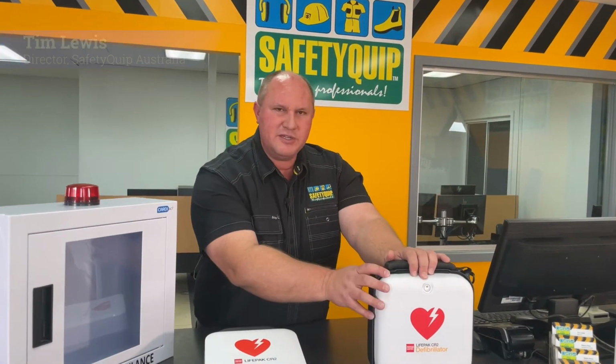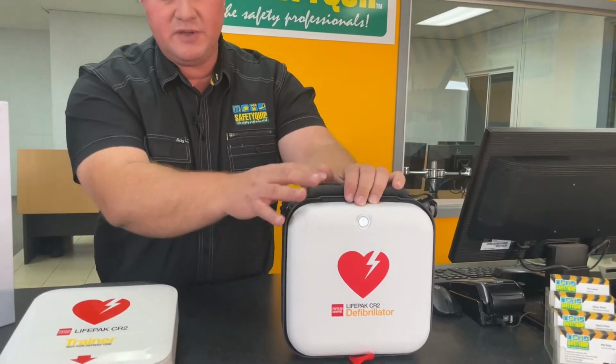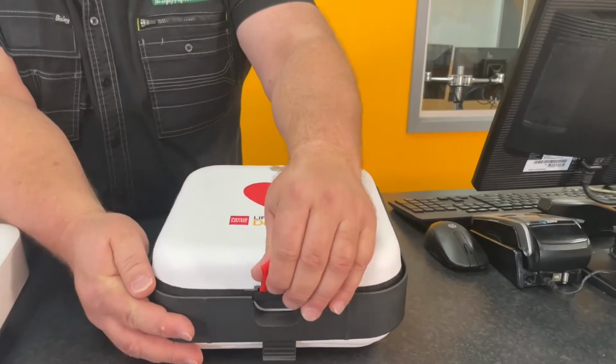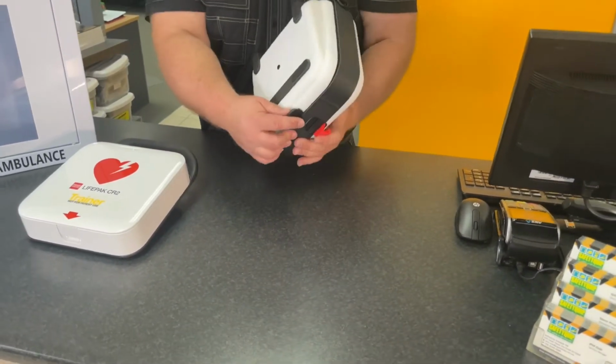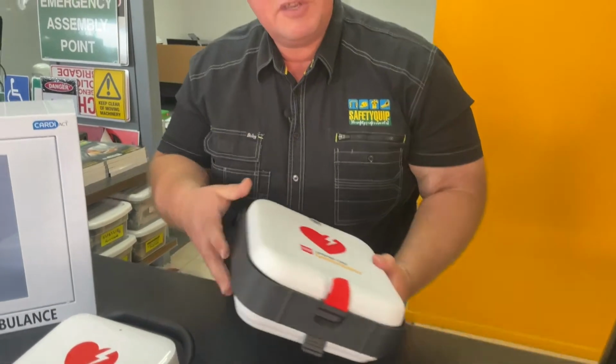Now there's a few reasons for that. The case provides a level of impact protection, so if it's dropped it's less likely to be damaged. Inside the unit there, the defibrillator looks the same as the training model here. There's also storage in the back of the unit for an AED prep kit. You know, the scissors, the razor, the CPR mask and so forth.